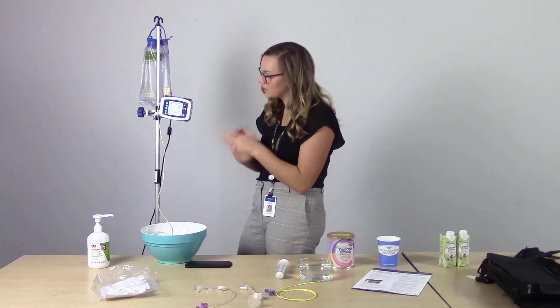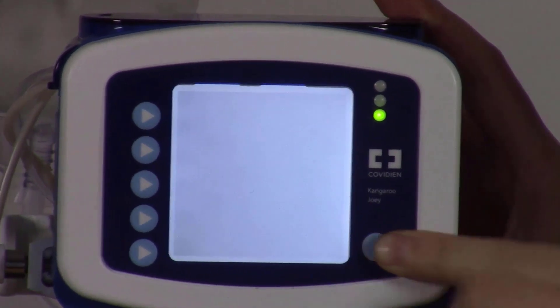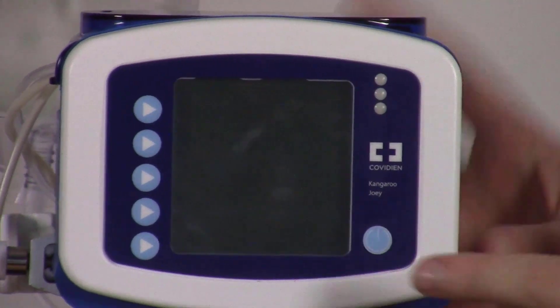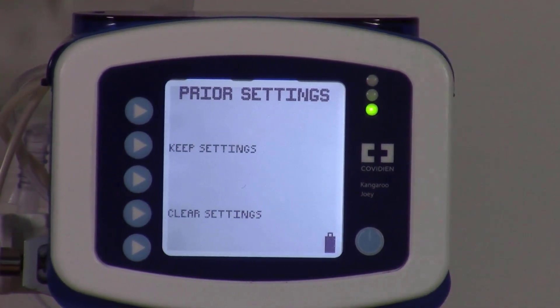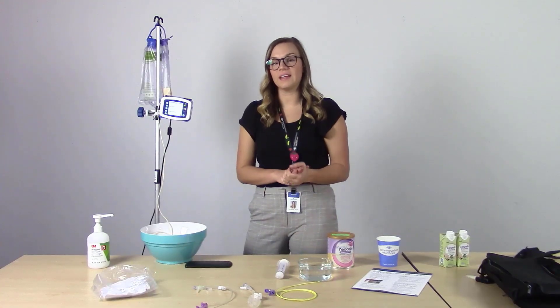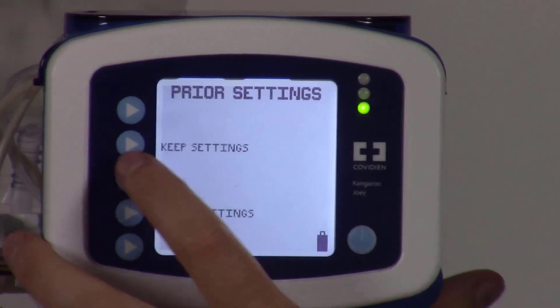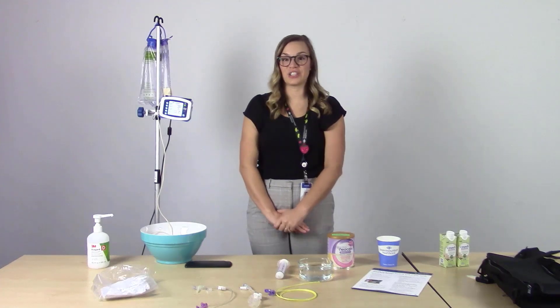We'll turn the pump off by holding the power button and turn it back on to show what it looks like after programming. Prior settings pops up with the options keep settings or clear settings. Because we just entered our desired feed and flush rate, we're going to choose keep settings. We can see the 36 mls per hour, 30 ml flush every four hours, our set is loaded, our tubing is primed, and we're good to start our feeding.